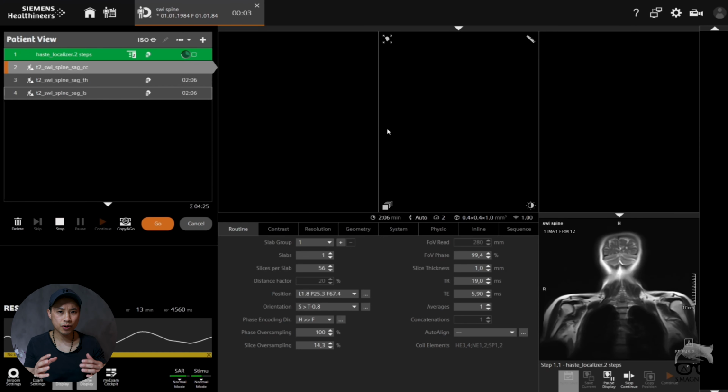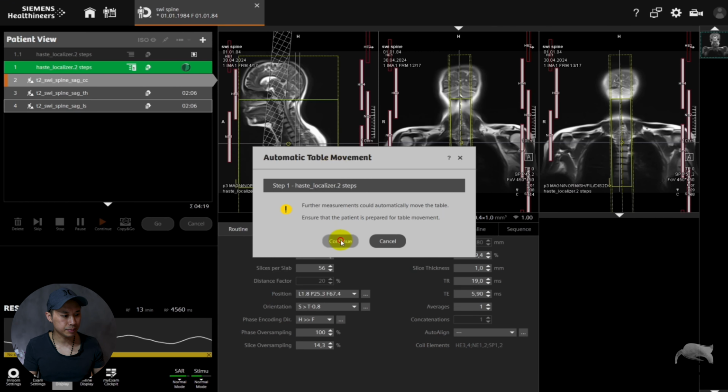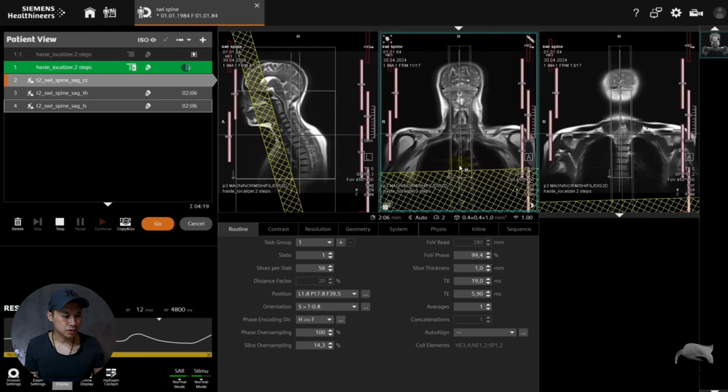First, I'm just going to show you how I position it, and then I'm going to share some of the parameters so you can adapt this to your scanner. You can see I'm trying to cover the cervical spine and then have a saturation band at the anterior part. I'm just going to do a positioning in the coronal plane as well.